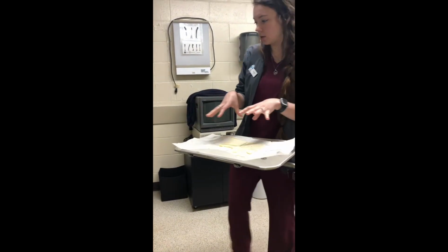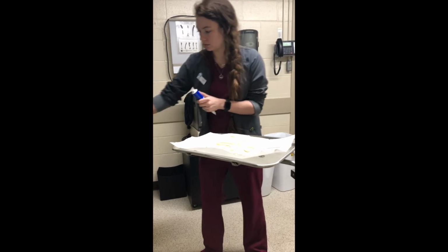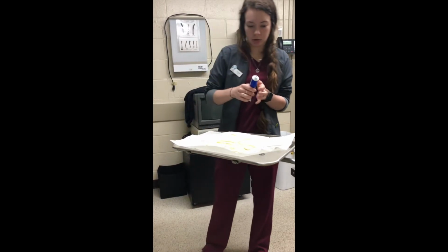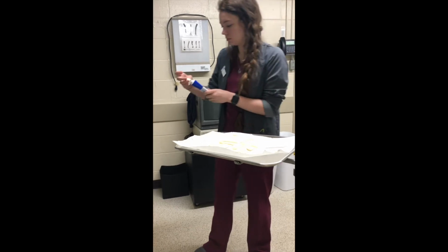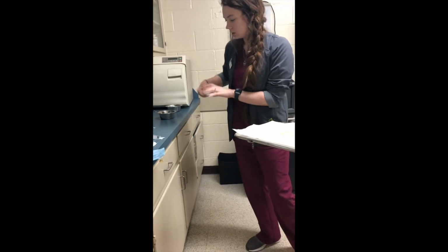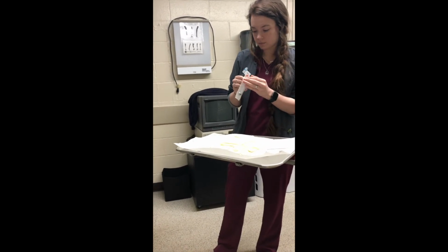So inside here is going to be used as my sterile field. I'm going to get some sterile lube and put it inside my sterile field. And I'm going to get my sterile syringe.